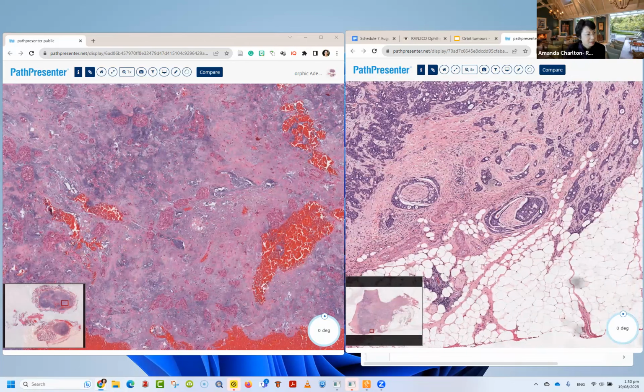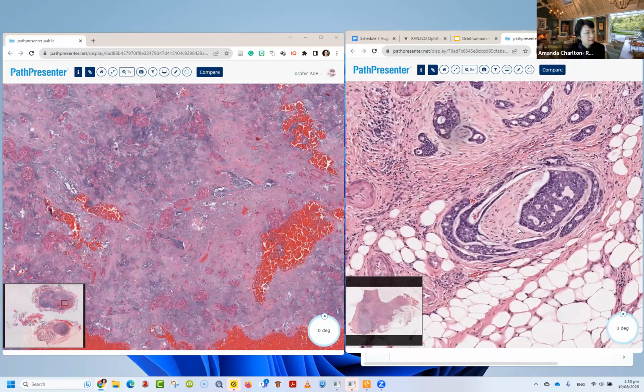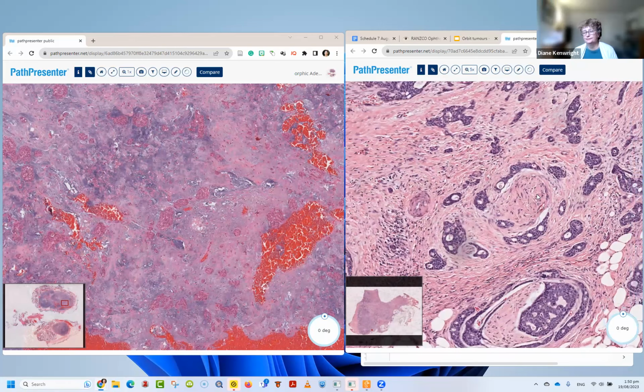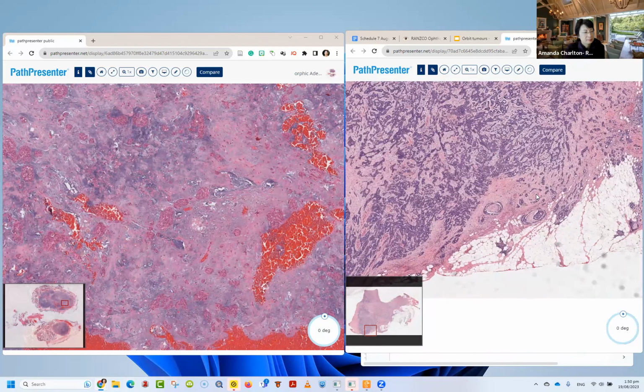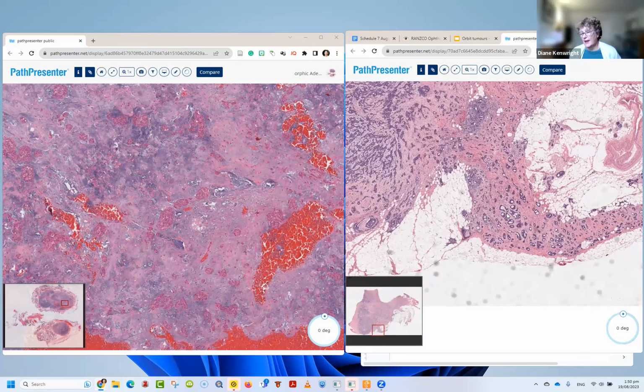So that's another perineural invasion, this crescentic shaped thing, another nerve. Here's another one. Spot it now. Wavy spindled cells. That's a nerve. Yep. So lots of perineural invasion here. And then there's the stage. So we don't expect you to know all the staging systems, but just note that it extends into fat.